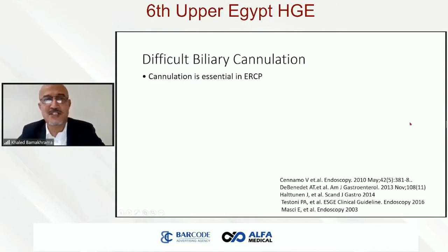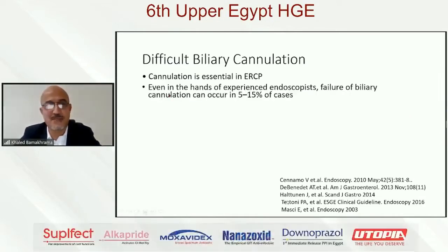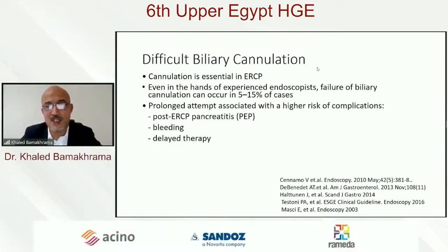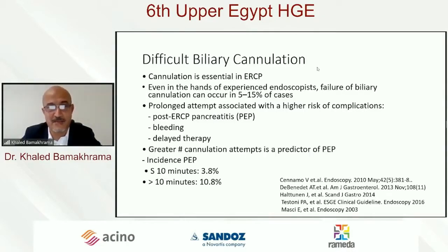So cannulation is essential in ERCP. No cannulation means no ERCP. Even in the hands of experienced endoscopists, the failure of biliary cannulation can occur in 5 to 15%. The problem of prolonged attempts is associated with a high risk of complications like post-ERCP pancreatitis, bleeding, and delayed therapy.